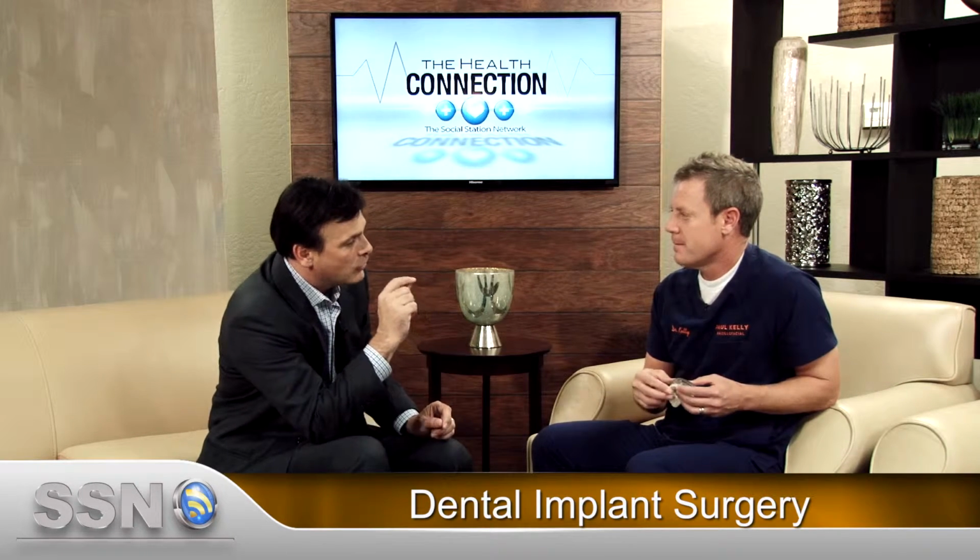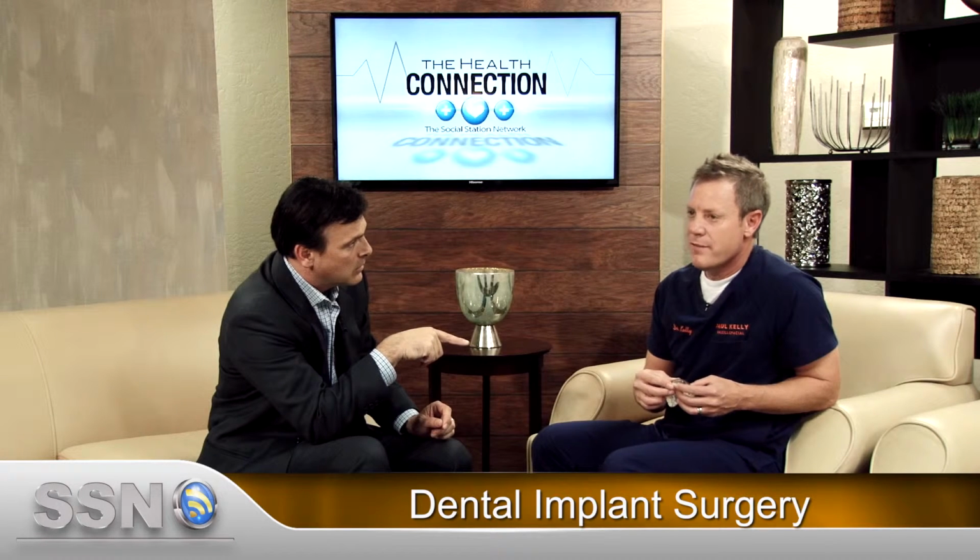Okay, so how long is your process? So in my office, you're in my office for about an hour and 15 minutes on the day of the procedure. Okay. The implant's placed into the bone, and then the implant takes 3 months to heal, or what we call integrate. After the implant's integrated, you're then released to go back to your general dentist, your family dentist, your cosmetic dentist, to then have what we call the final restoration or crown of the tooth.